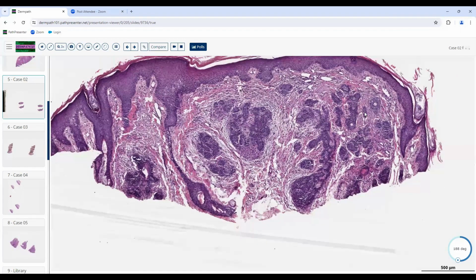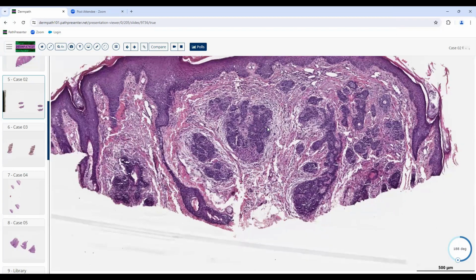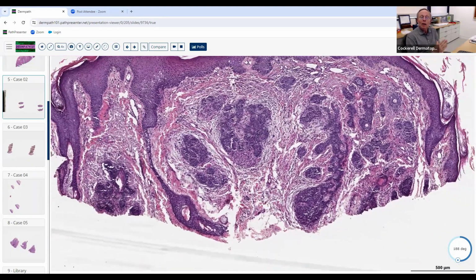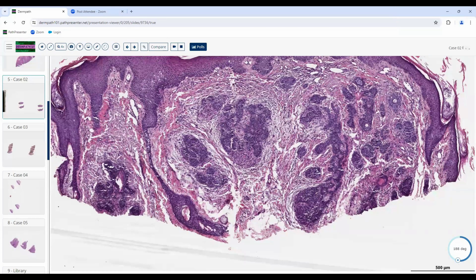clefting. What kind of differentiation do you think this is before we go to that level? So again, we have epithelial or non-epithelial? Epithelial. And then just like the last one, which epithelium do you think we're looking at here? More like follicular. Good. Now, the last one we asked about is which part of the hair follicle is being recapitulated here? Like the hair bulb. Good. The inferior portion, right. The very lowest part. Very, very good.